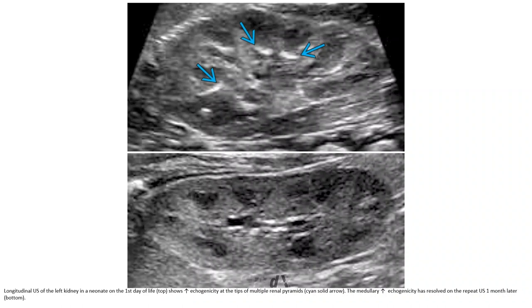This shows the left kidney in a neonate on the first day of life. There is increased echogenicity at the tip of multiple renal pyramids. The medullary increased echogenicity resolved on a repeat ultrasound.